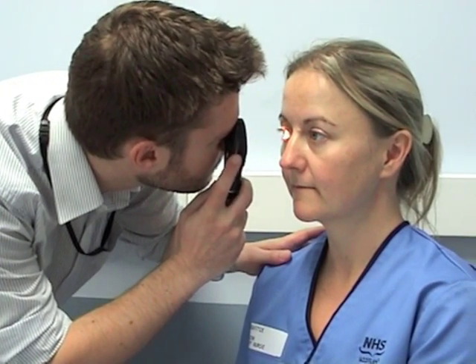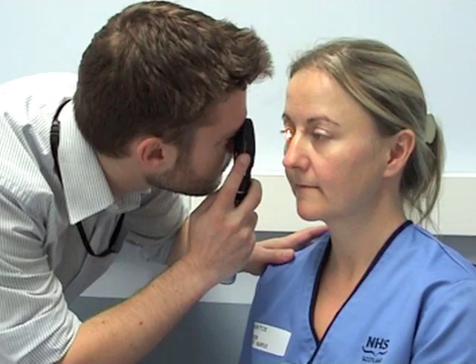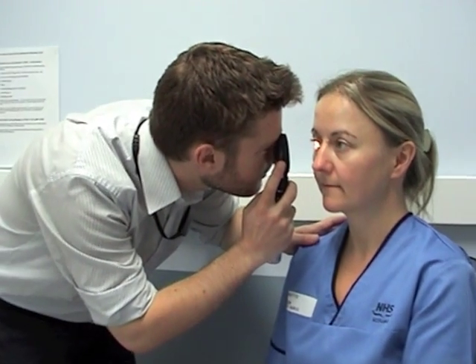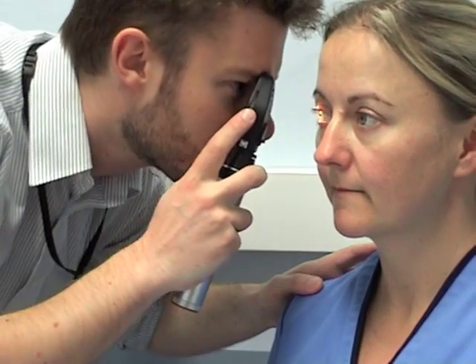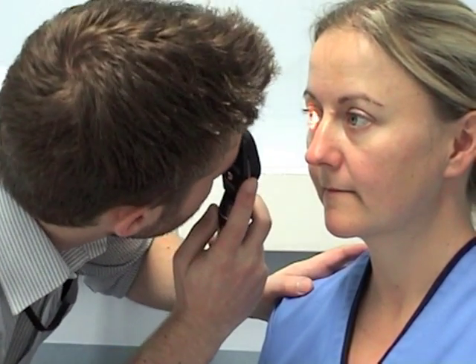Then dialing down from a 10 towards 0 shifts the point of focus from the front to the back of the eye, i.e. towards the retina, and this should be stopped when any retinal features such as blood vessels come into focus.